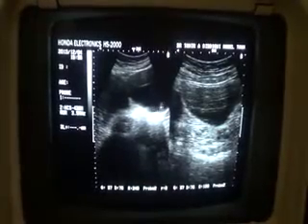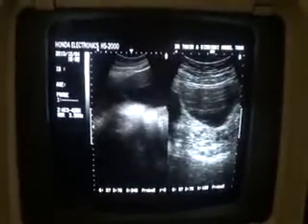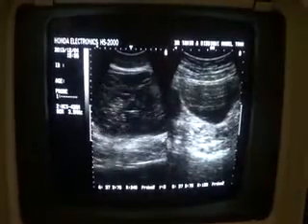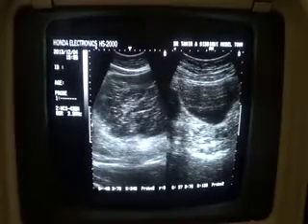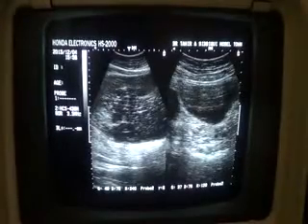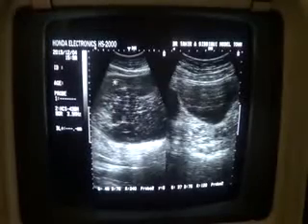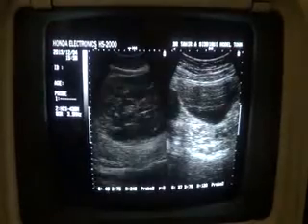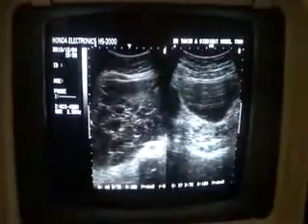This is the urinary bladder in longitudinal section, and this is where the cyst starts from the right adnexa and goes all the way along to the epigastric region. And we do see posterior wall acoustic enhancement. These are the debris, internal echoes. These are the septas. Here you see.